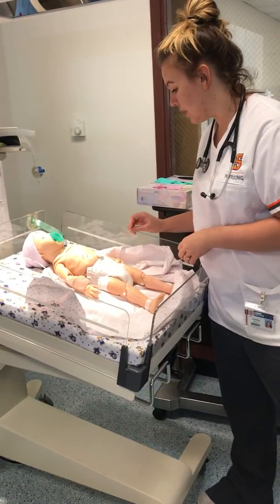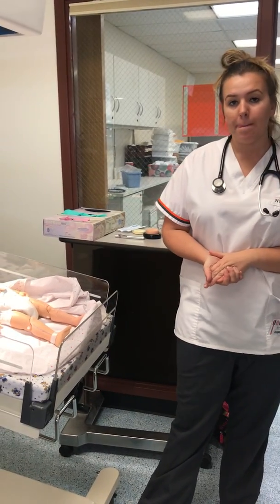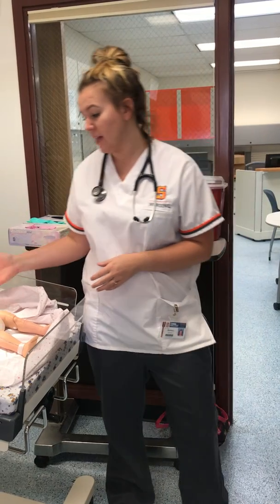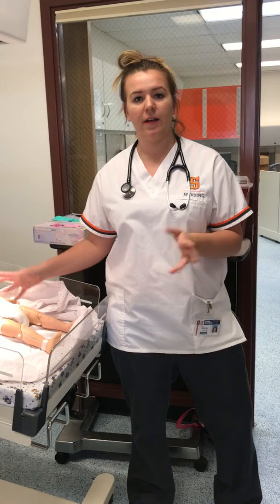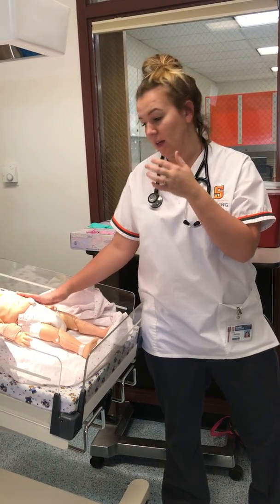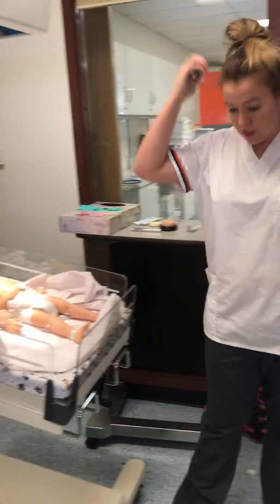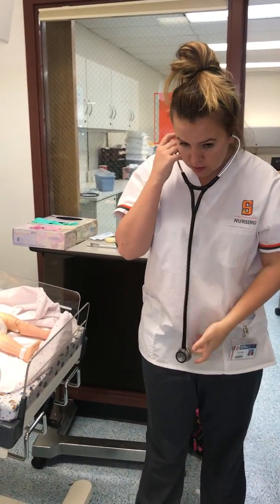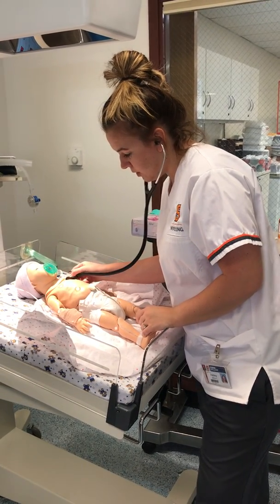I would then move into the respiratory system. Also in the cardiac, I would assess for diaphoresis, see if they're sweating, anything like that. Now, moving down into the pulmonary system, I'm just going to listen to the 6 lung sounds on the front. And I'd be doing these bilaterally.